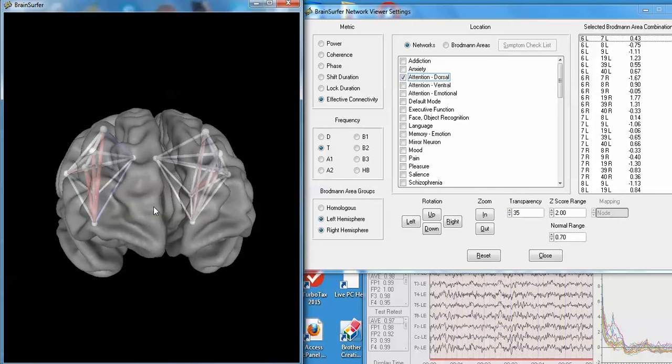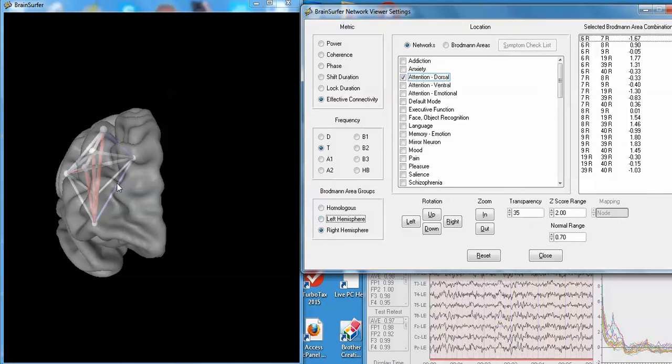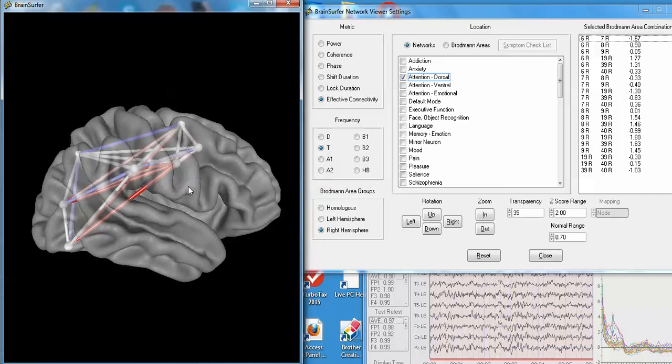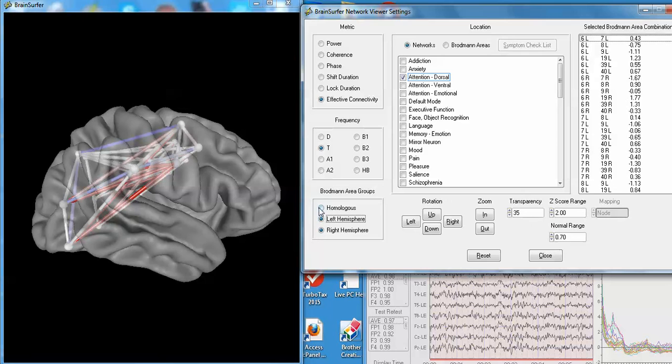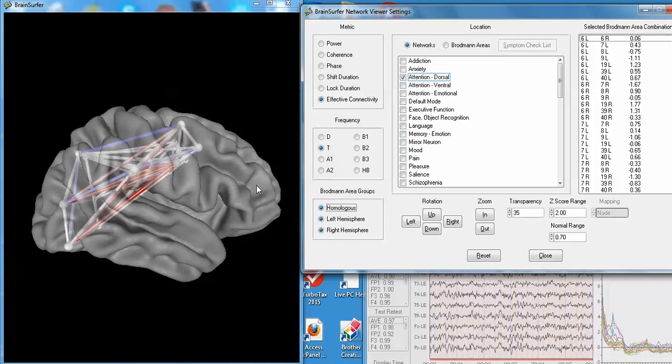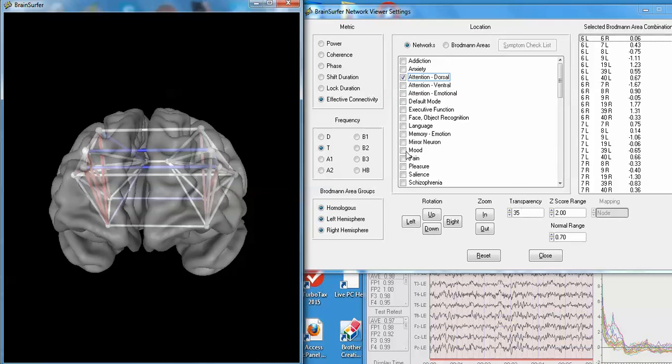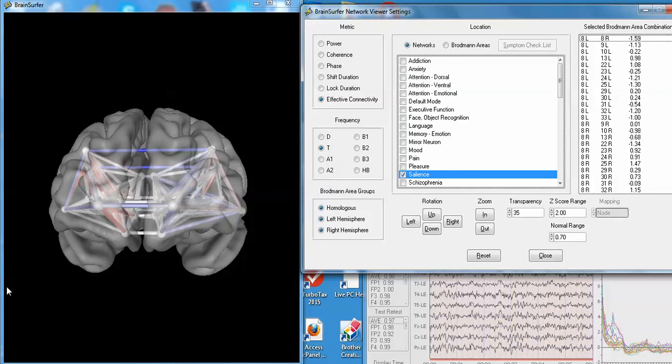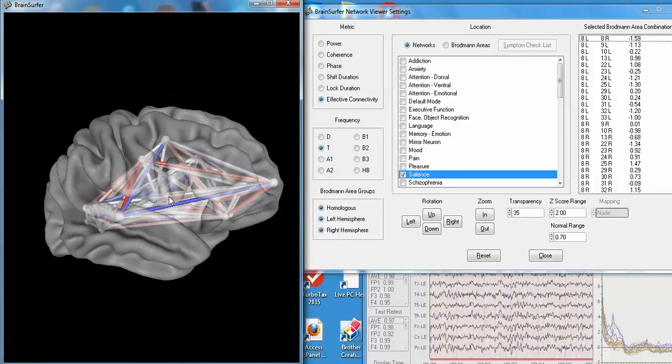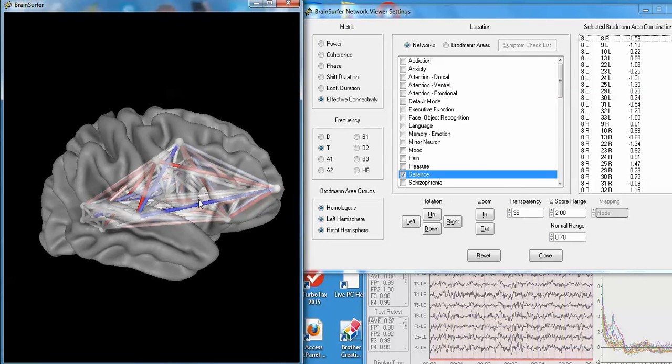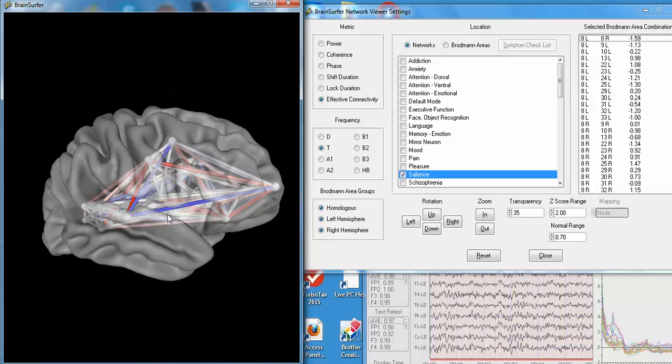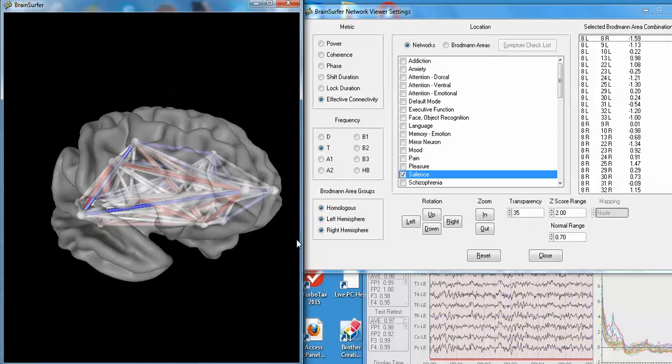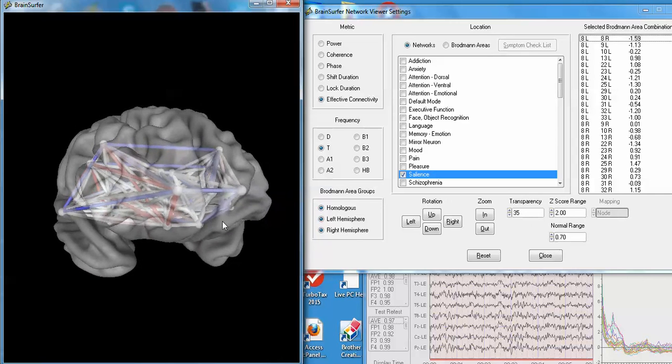Or you can just look at the right hemisphere and not the left. So you get great flexibility with the BrainSurfer Network Viewer to evaluate different networks in the patient's brain to determine the linkage of the patient's symptoms to the dysregulation in parts of the brain. And here's the salience network, which is especially important in a variety of psychiatric disorders. You can look at the magnitude of deviation from normal. You can change the z-scores to see which ones are most deviant. You can change the z-scores up until this network gets completely white, probably three or four standard deviations. The network will be completely normal. It's in some particular range at a particular frequency that the deviations from normal are present.